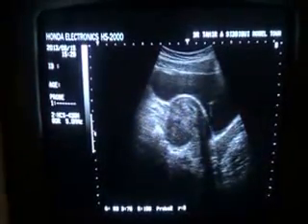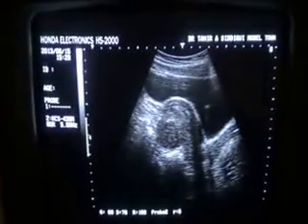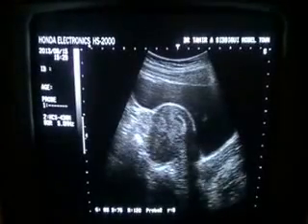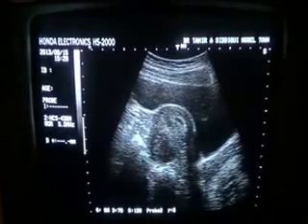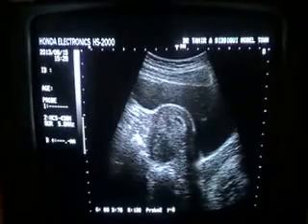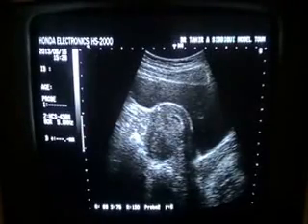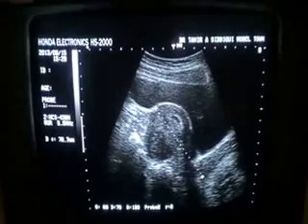This is the ultrasound study of a case of infertility. Married 8 years. She has been visiting a lady health visitor in her area. This is the urinary bladder, and the lady doctor has been using some medicine intravaginally, and now she has come with this severe pain in the pelvic region after visiting the lady doctor.